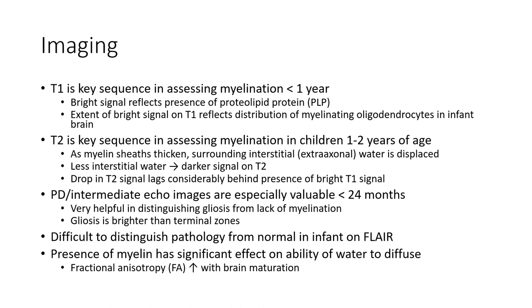T2 is the key sequence in assessing myelination in children 1 to 2 years of age. As myelin sheaths mature, surrounding interstitial water is displaced, resulting in low signal on T2. Dropping T2 signal lags considerably behind the bright T1 signal.